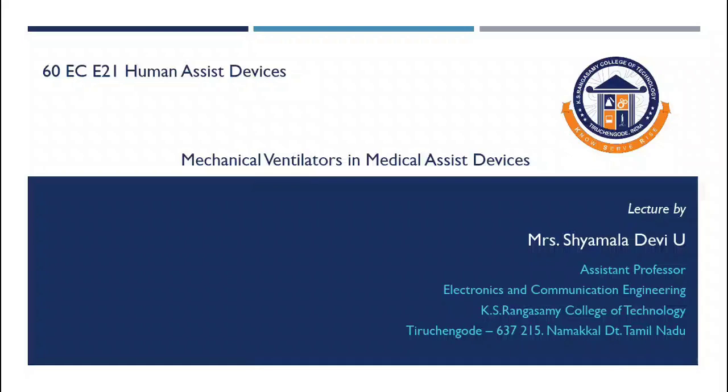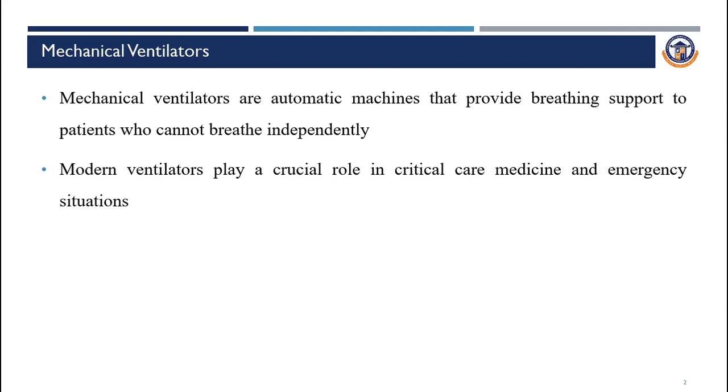Welcome all. Today I am going to talk about the topic of mechanical ventilators in medical assist devices. Ventilators are life support devices that provide mechanical breathing assistance to patients who cannot breathe on their own. So these machines act as intensive care medicine by maintaining respiratory function when natural breathing is compromised.